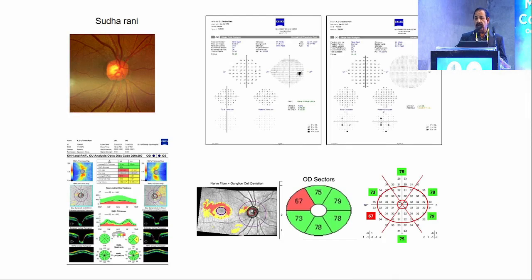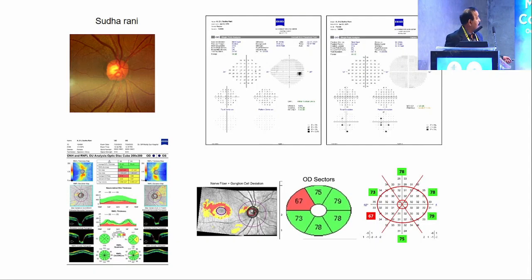What is the role of OCT in early glaucomas or glaucoma suspect? This patient was not suspected on the basis of IOP. The fundus looks normal. Almost visual fields normal. Even RNFL is normal. But here the ganglion cell thickness started 67. So at 67 you don't get any defect. When I talked in the GCI, I talked about indications of 10-2. Now I tell you, when you need not do 10-2: when the GCI thickness is more than 60, you need not do 10-2, because even if you do 10-2 it will come normal.